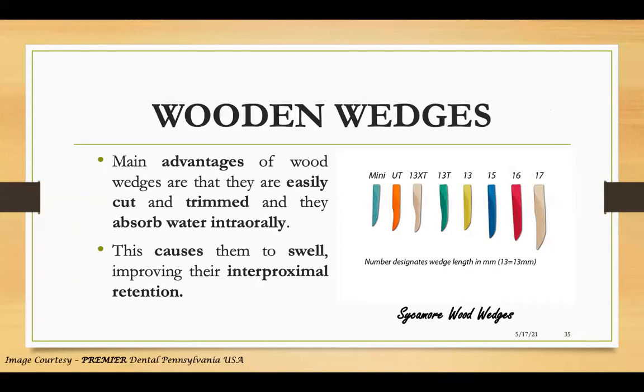Quickly moving to wooden wedges, the main advantage of wood wedges is that they are easily cut and trimmed and they absorb water intraorally. The reason we put wooden wedges, medically wooden wedges, is so that they can absorb water intraorally or any contamination or crevicular fluid. This causes them to swell, improving their interproximal retention, right?